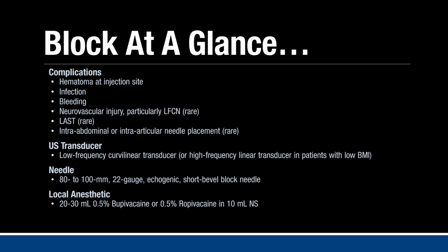An 80 to 100 millimeter 22 gauge echogenic block needle should be utilized. I typically use the 100 millimeter length when performing this block in the emergency department. The PENG block is a high volume block, and 20 to 30 milliliters of 0.5% bupivacaine or 0.5% ropivacaine in 10 milliliters of normal saline is appropriate for long duration analgesia.